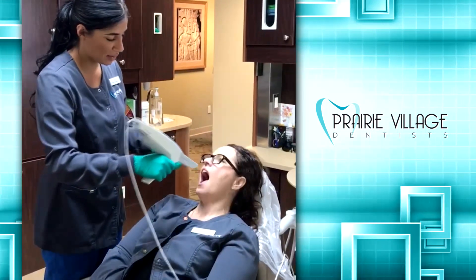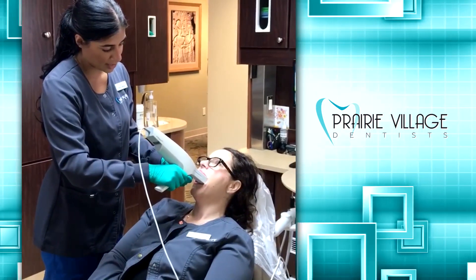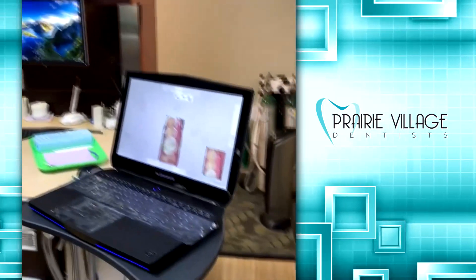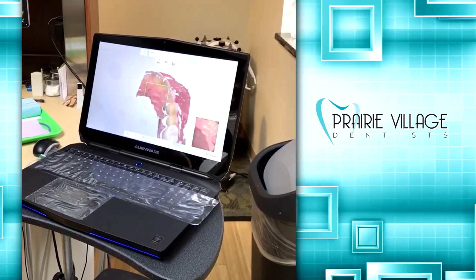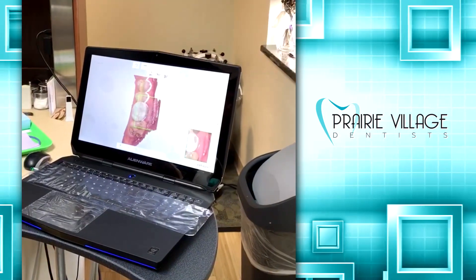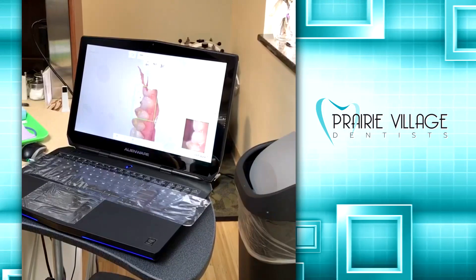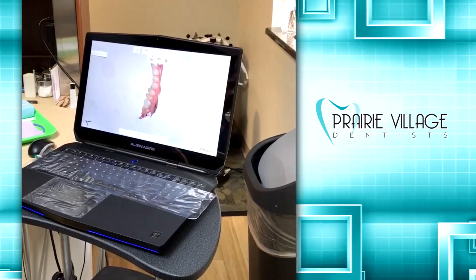Come take a look at what it's doing — super quick, super easy to use. I love how it gives us that instant image. And that's just a little demonstration of it, so check it out when you're here.